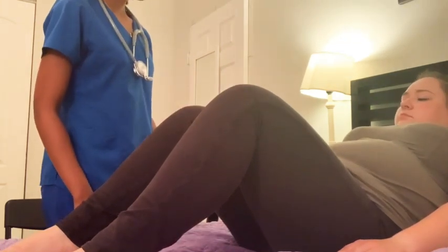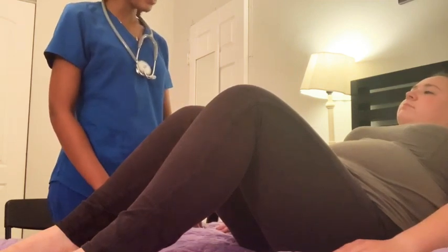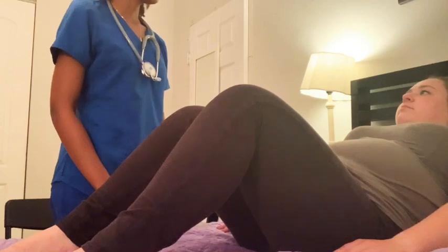For the result that's greater than 0.9, this is normal, but a result less than 0.39 is considered abnormal. It's a strong indicator for peripheral vascular disease, and anything in between is mild to moderate disease.